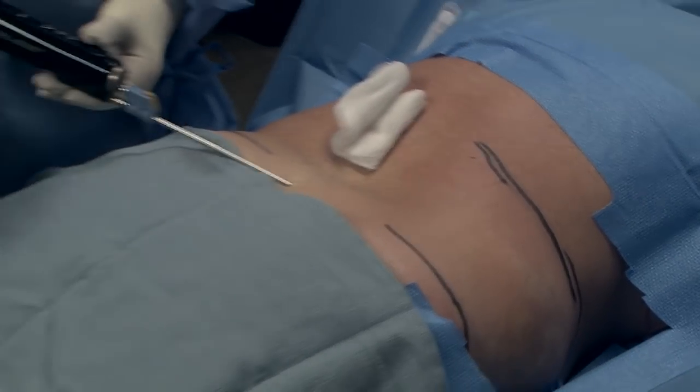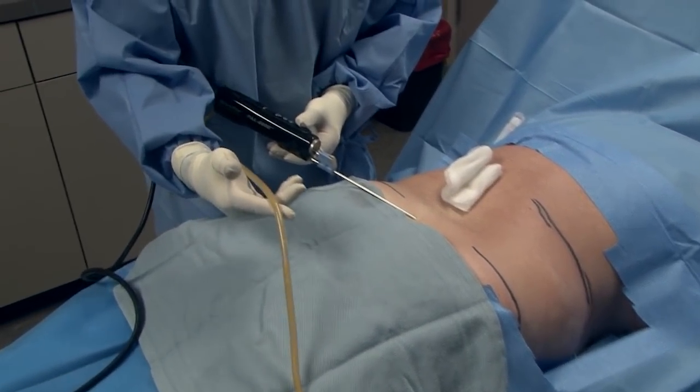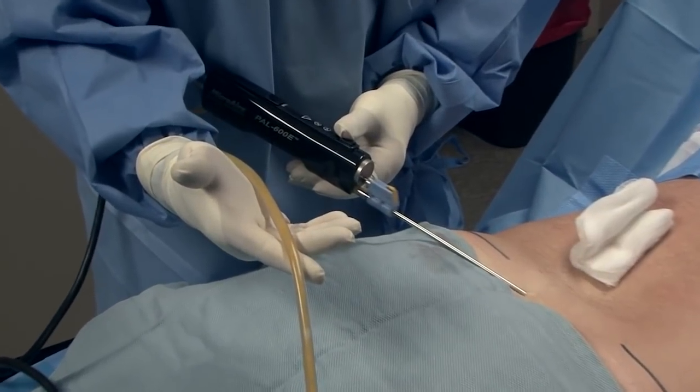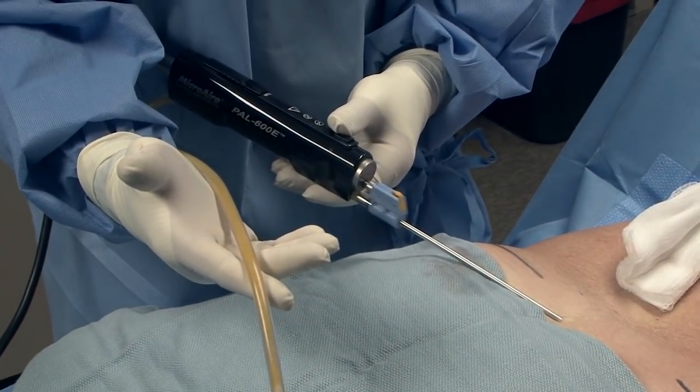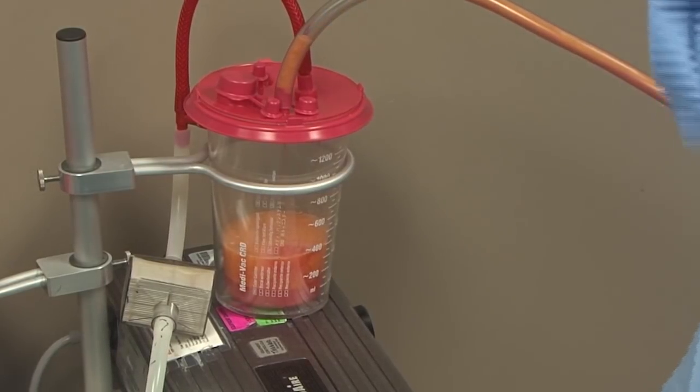So we're suctioning, and as I mentioned, this is the tubing. The yellow that you see in the tubing is the fat cells being taken out of the area we're working on, which will be disposed of later. These will never grow back in your body.